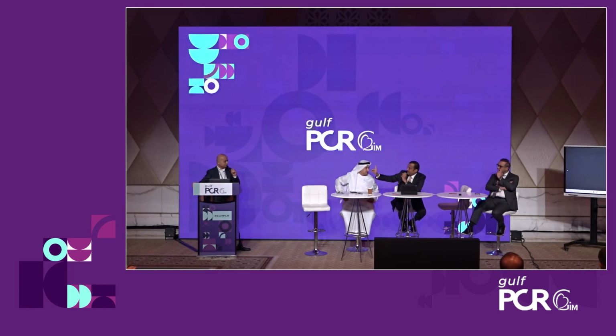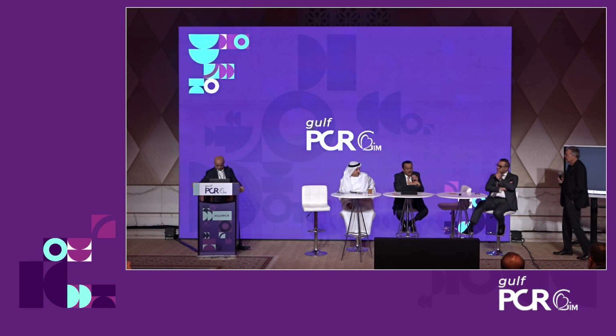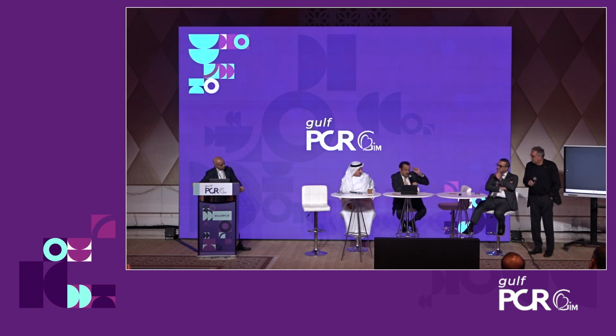Okay, I have a technology question now. I think, Ahmad, just 1 second. I think we need to take out our interventional hat. We're used to having a severe stenosis. It has to be fixed. You have to see a good result immediately. For blood pressure, we've been treating blood pressure for a long time, and you know that when you improve the medication, it takes time. So we have to get used to that this technology will result in gradual improvement of blood pressure.